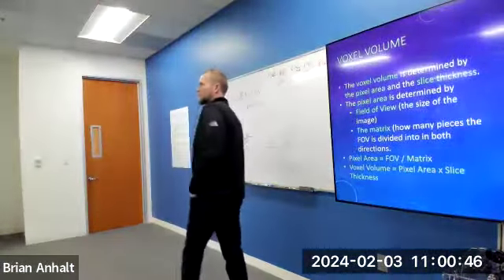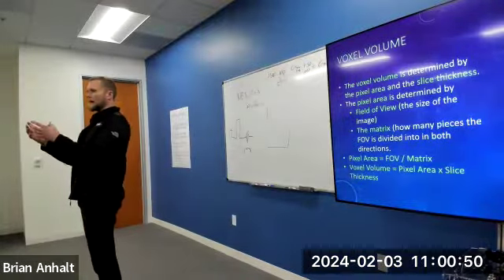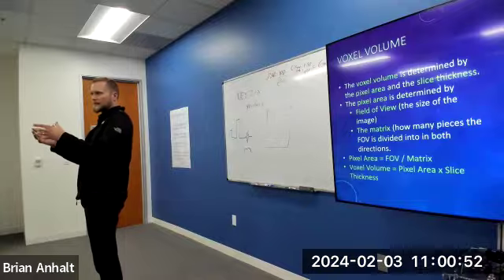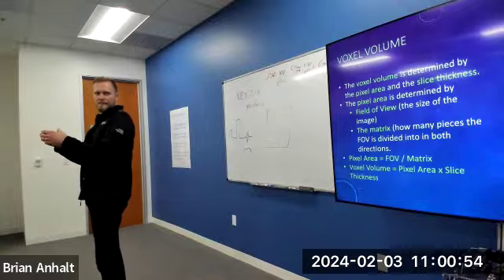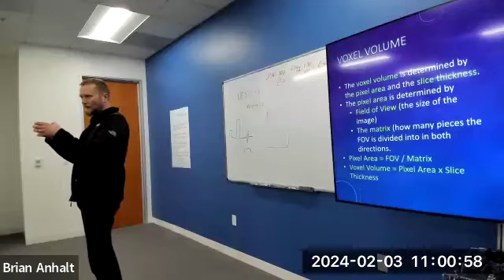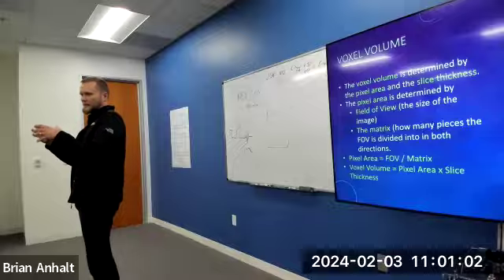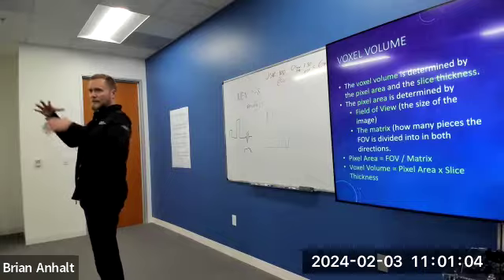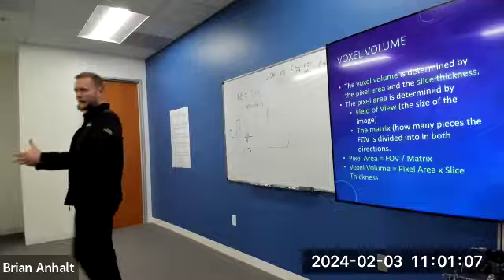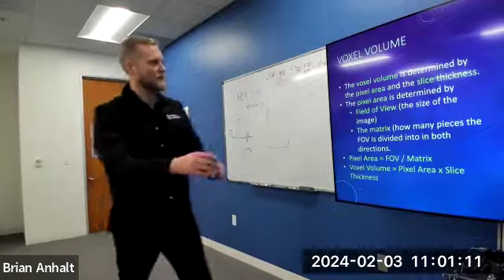Voxel volume, so think about volume as like a box, right? If you look at a box, you have a small box that has a small volume. That's how much space it takes up, right? So if I need to ship a watch to somebody, I'm gonna have a small volume box that I'm gonna ship it with, right? If I need to ship a basketball to somebody, the box is gonna have a larger volume. It's gonna have more space inside it so that I can utilize that room to ship what I need to.